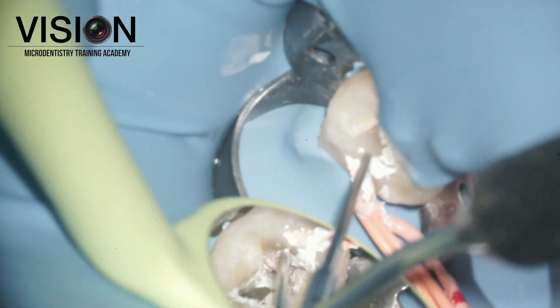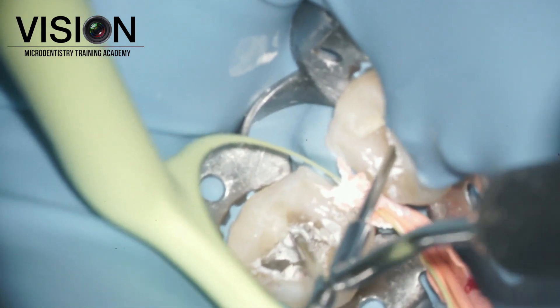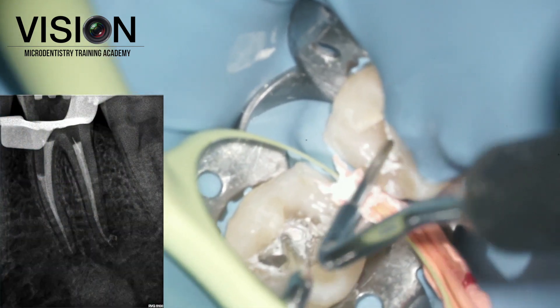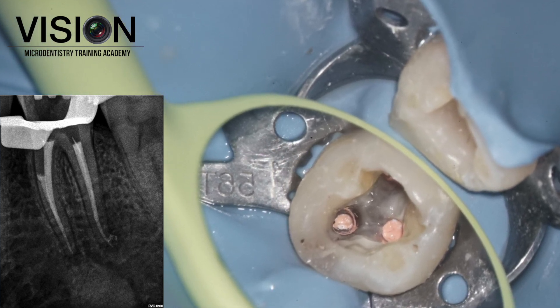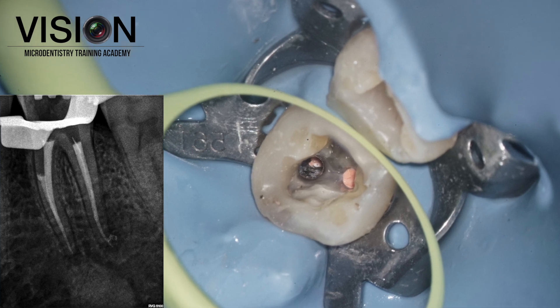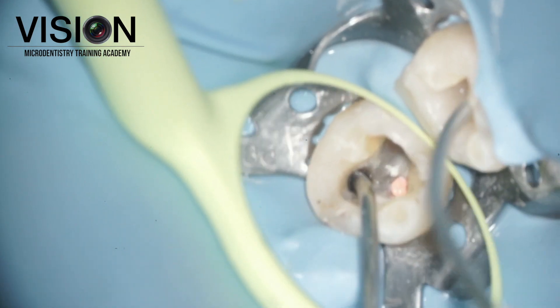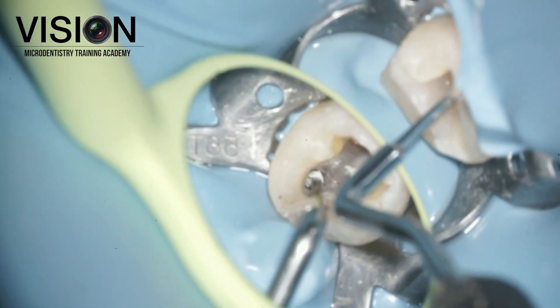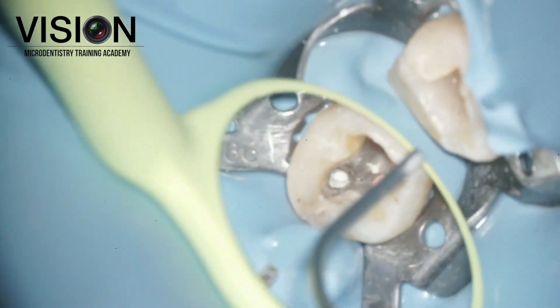Once that was done, we cleaned up the excess sealer and cement to get a good clean view for the next step. On the radiograph, you can see that one of the canals was only down packed till the middle third, and the remaining space was planned for sealing the perforation. We planned to use MTA to seal this perforation, using an MTA carrier to pick up small increments and place them in the area between the junction of the coronal and middle third and the orifice level.